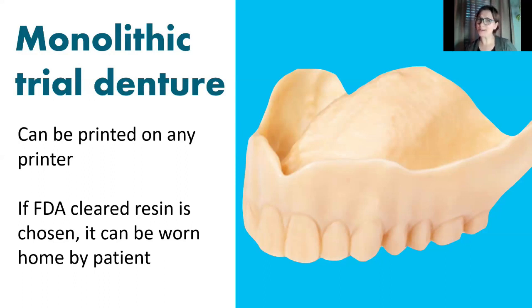In addition to being a short amount of time, the wax is pretty unstable. And one of the bigger pain points for me is when I'm trying to evaluate occlusion, but the wax starts to soften. And so the patient bites down too hard, and now we've closed the vertical. More often, number 7 or 10 falls on the floor, and we're trying to get it sanitized and sterilized and put back into the denture. Or we let the patient look at the denture without number 7 and/or 10, and they're like, well, I'd like it better with all the teeth. And so there's a lot of pain points that come with a conventional wax tooth try-in.